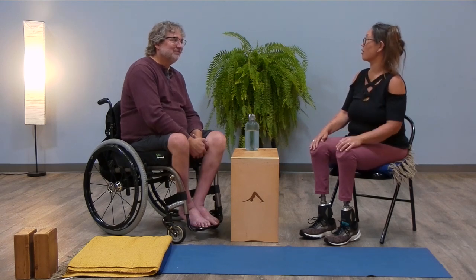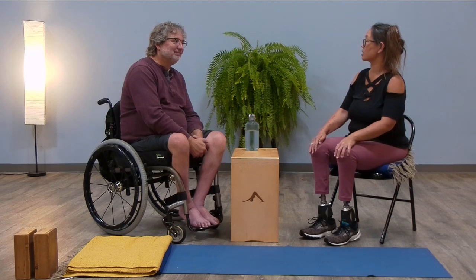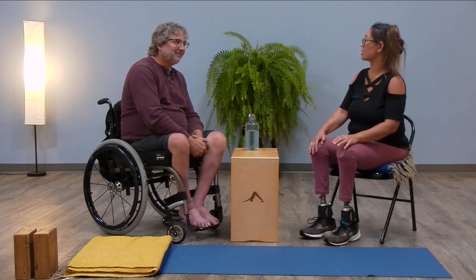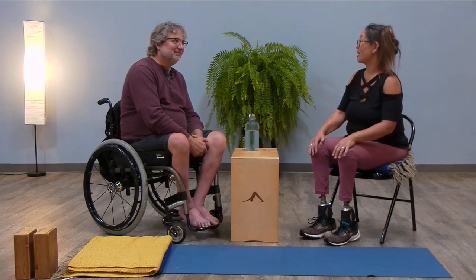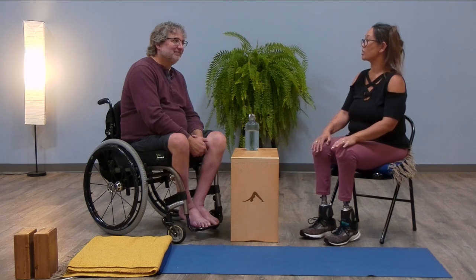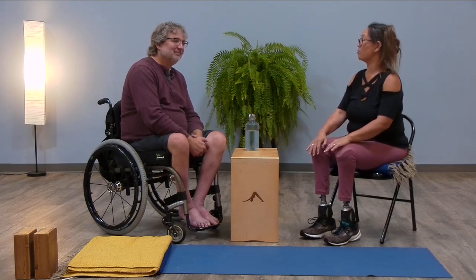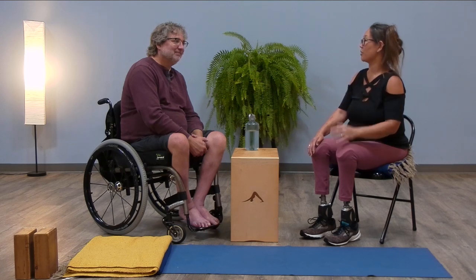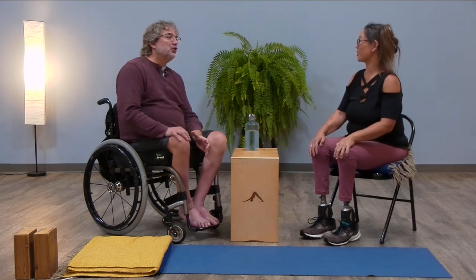I wondered why — it had been a long time since I'd been able to practice at that level. I decided I think it's the feet. These feet aren't as dynamic when the motor is turned off, which is great for a standing practice. I can't seem to remember to charge them on a regular basis.